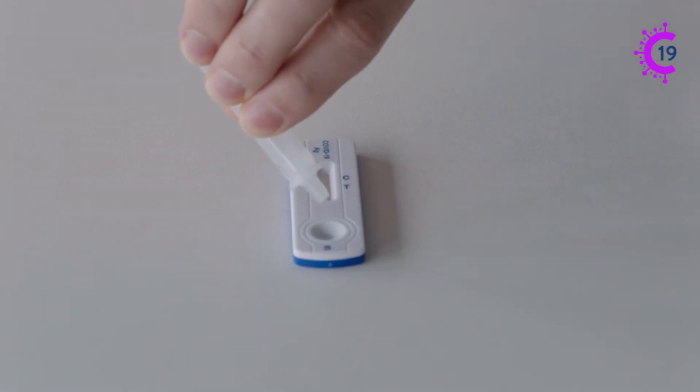Turn the tube upside down and then carefully squeeze four drops of the solution onto the specimen well of the cassette. Start the timer.